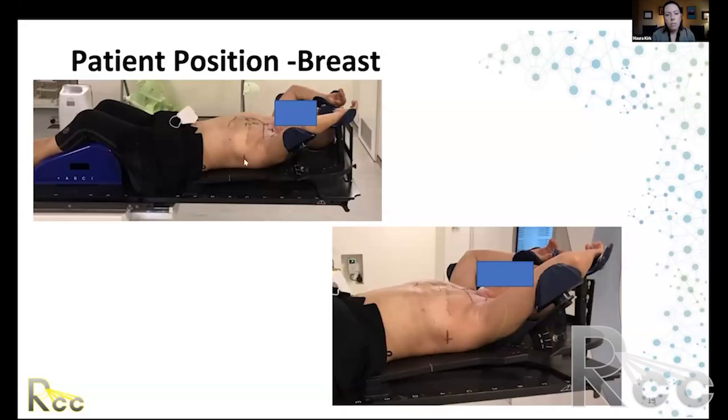You can see that this patient is a post-mastectomy patient, and it looks like they're marked where their isocenter would be. That can be difficult sometimes for intact breast patients, because if you're marking the patient on their breast and they have a pendulous breast, it's not really a reproducible mark on the body that you can line up to.